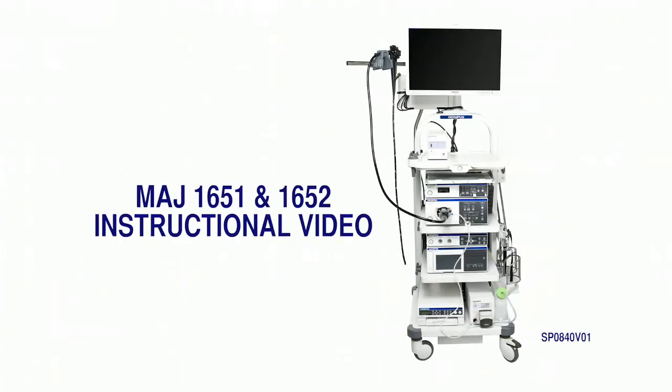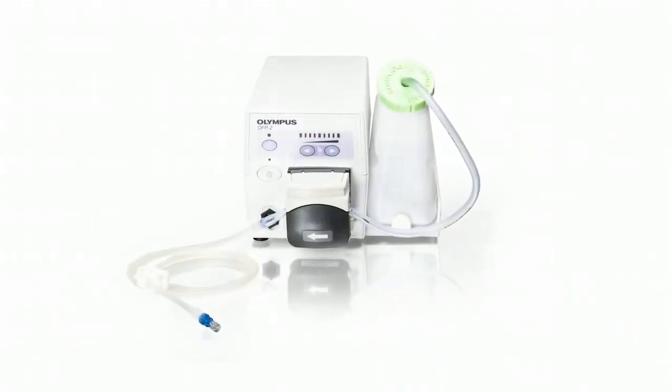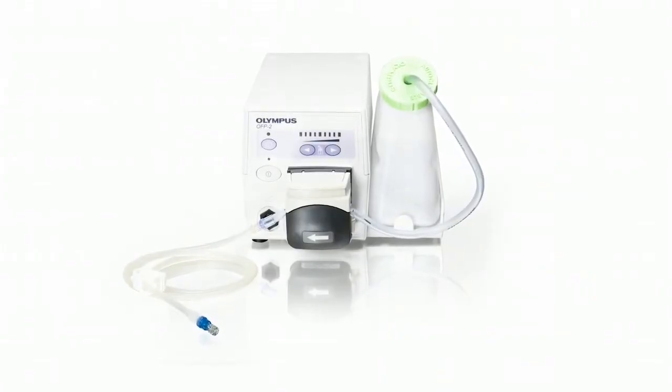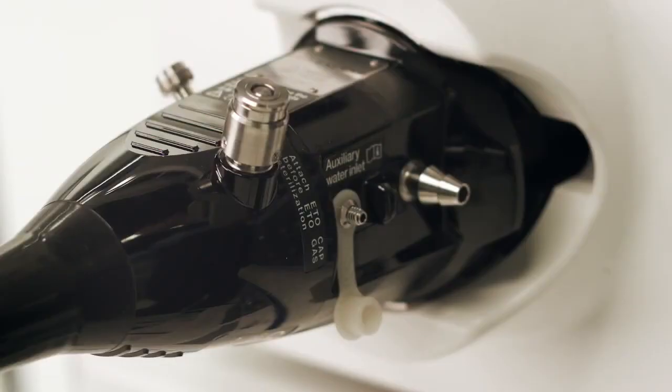Welcome. This instructional film will cover how to use the Olympus MAJ 1651 and MAJ 1652 disposable auxiliary channel water tube set and adapter, which have been specially designed for use with your Olympus OFP or OFP2 endoscopic flushing pump and your Olympus endoscopes that include an auxiliary channel water connection.